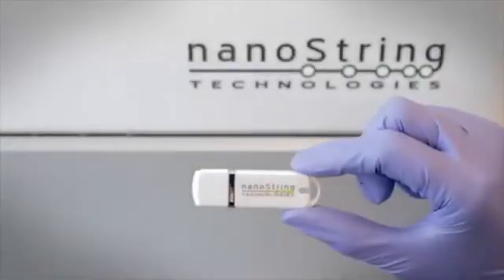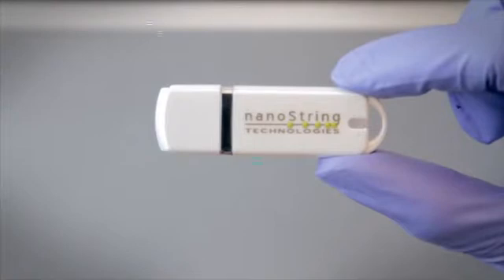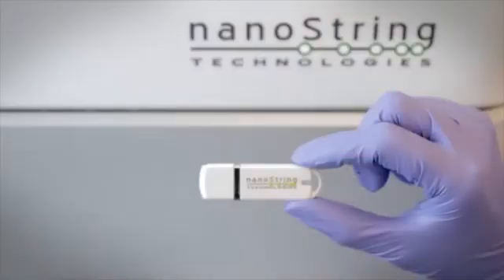With each code set, NanoString provides a USB stick that contains an RLF file specific for that code set. It is very important to use the RLF file that is shipped with your code set in your experiments. The USB drive also contains a template for setting up CDF files on a personal computer.